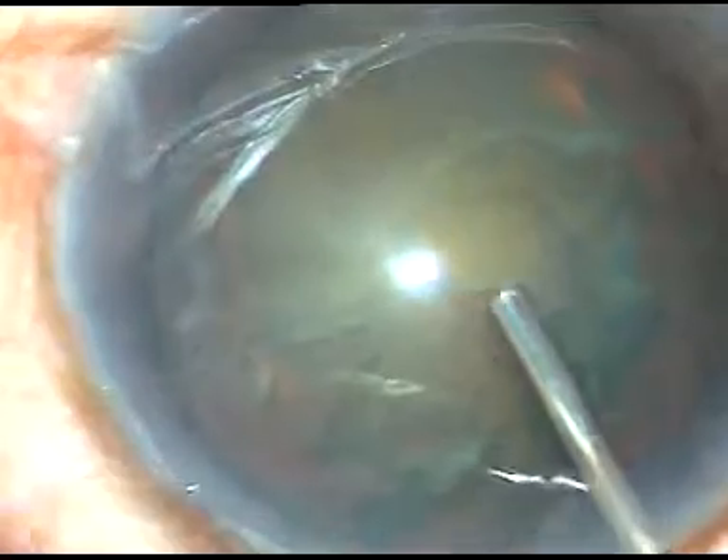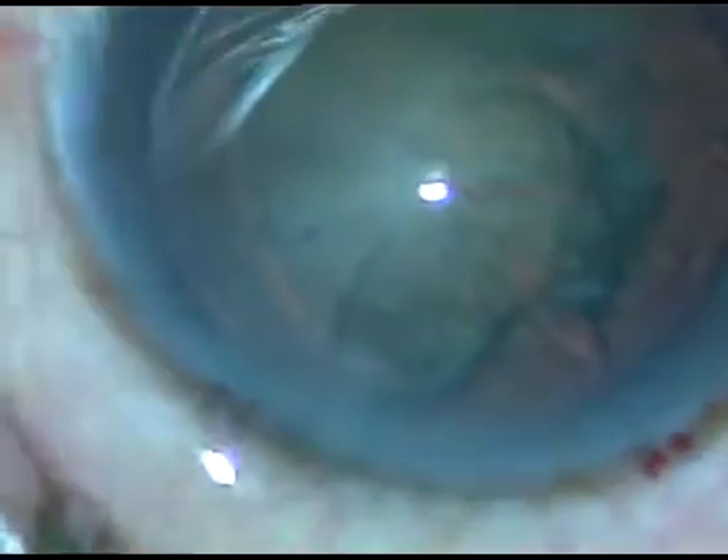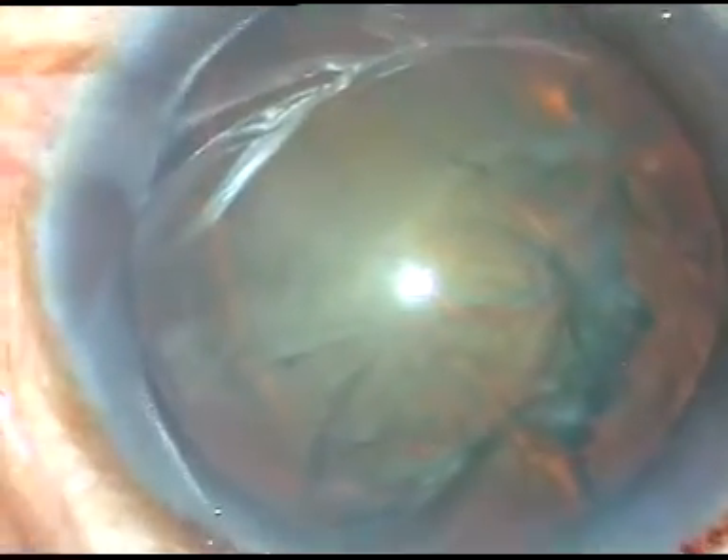A viscoelastic substance — dispersive visco — is injected again, and now is the time to enter into the eye with the phaco handpiece. In this case, the Totalys Easy phaco machine is being used.